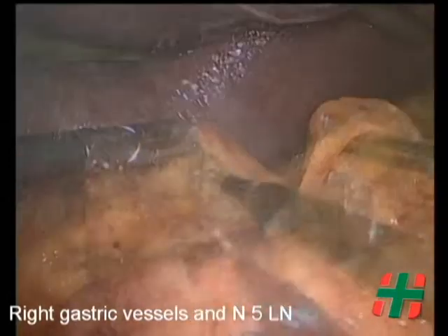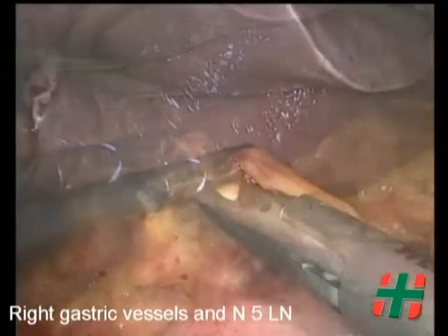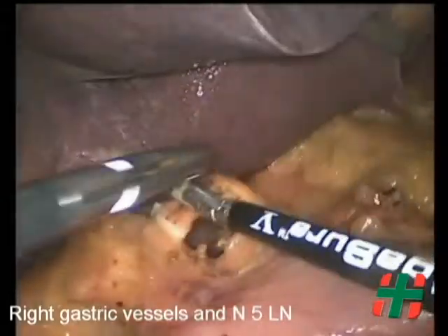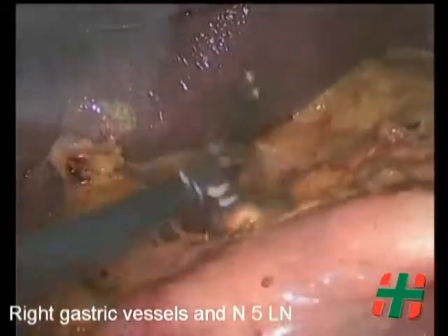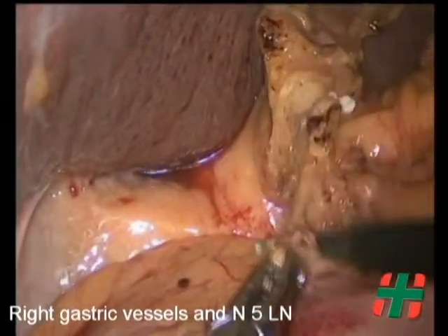Subsequently, the right gastric vessels are dissected and lymph nodes of station number 5 are cleared. Subsequently, the right gastric vessels are dissected and lymph nodes of station number 5 are cleared, along with station number 7.